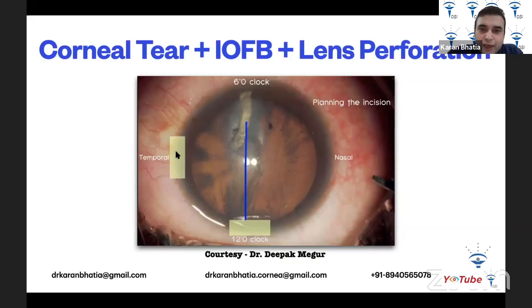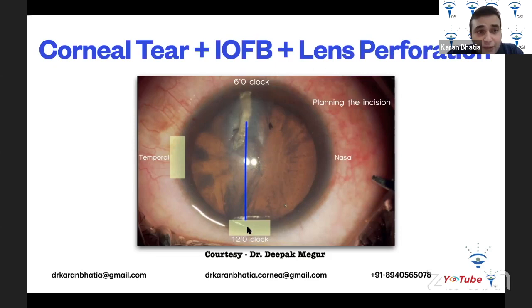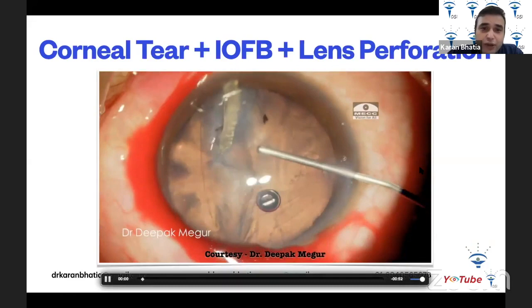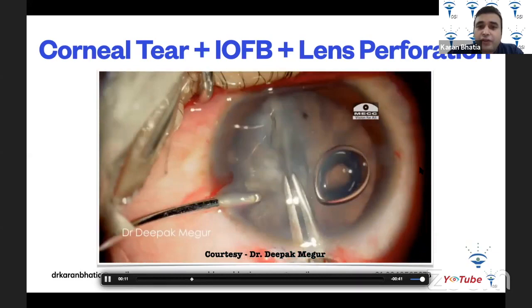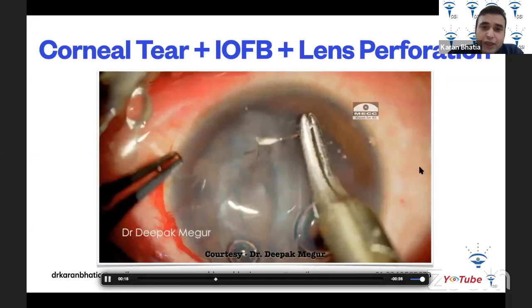The incision could be temporal, at 12 o'clock, or superior. However, this foreign body is longitudinal and long, making it very difficult to remove via a temporal incision. Therefore, Dr. Magoor chose a 12 o'clock incision, which makes it easier to remove the foreign body and repair the tear. OVD is injected after making a side port, followed by forming a scleral tunnel. The next step is removal of the large metallic foreign body from the cornea and anterior chamber.